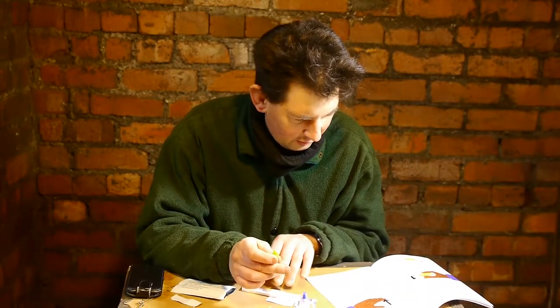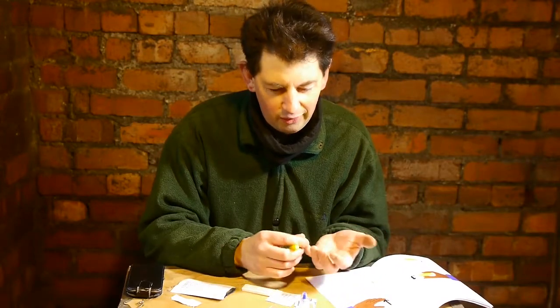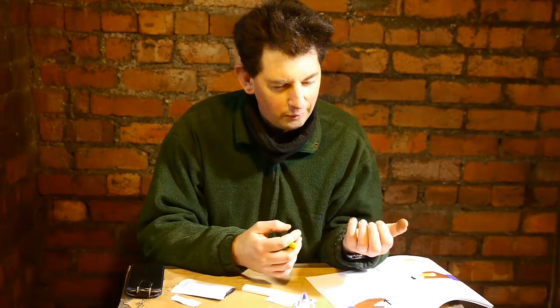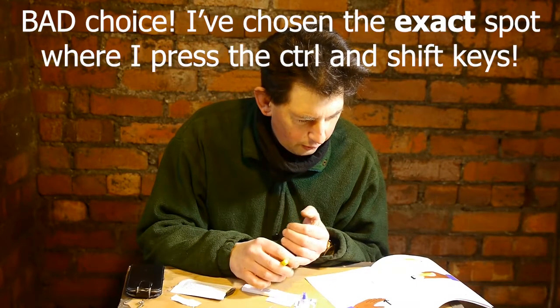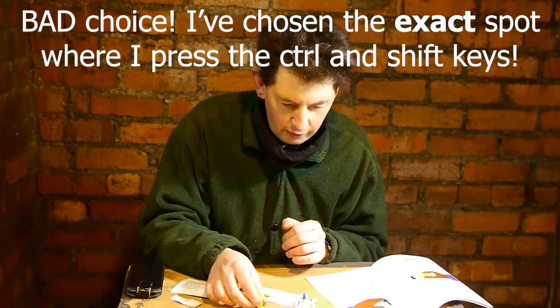Right, so I'm going to use a bit of my little finger, because I type and I play keyboard and instruments and things, and I figure that... Ooh, maybe I should use the other hand, because I play violin sometimes as well. That could be painful. Oh well, let's just do it. Choose a spot, fleshy part, side of a finger, wipe the area with an alcohol wipe.